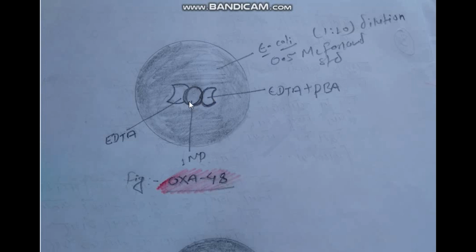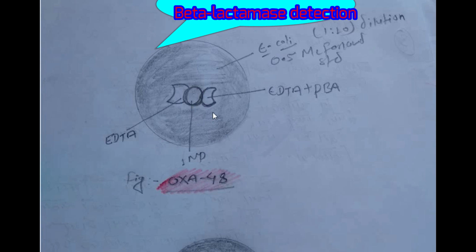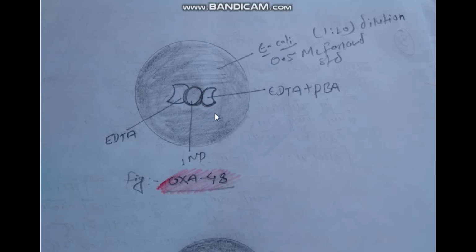The plate was then incubated overnight at 35 degrees Celsius in ambient air. After 18 hours of incubation, the plates were examined for either indentation or flattening.